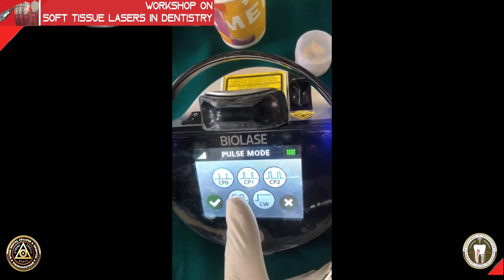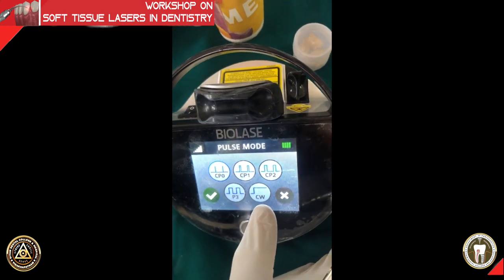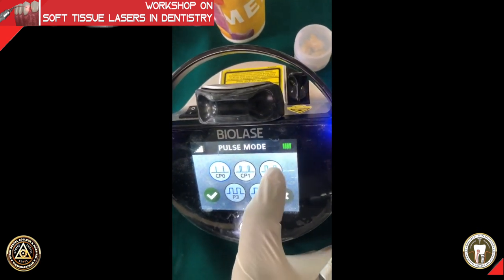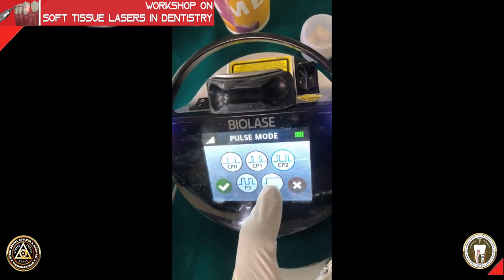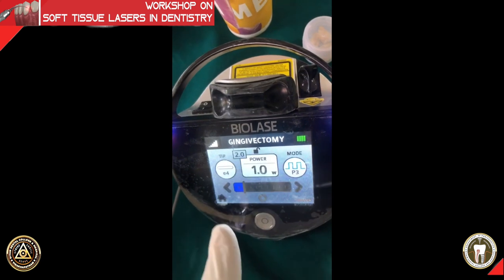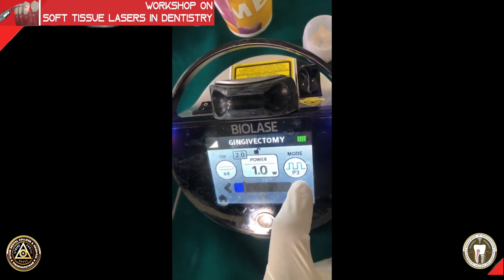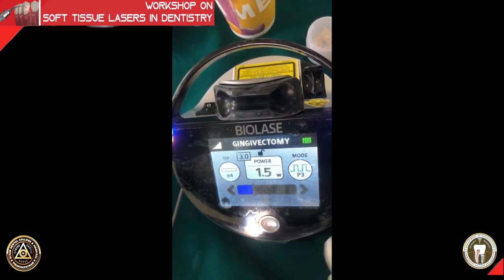We will now show a de-epithelization procedure in pulse mode on a tomato. We are using 1.5 watts with a 50 percent duty cycle.